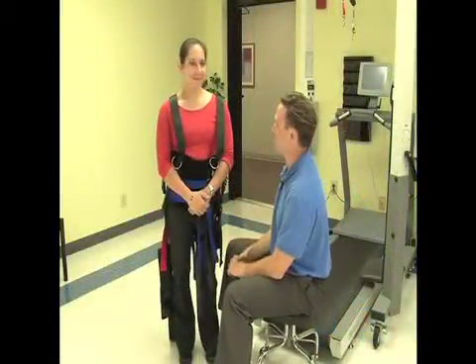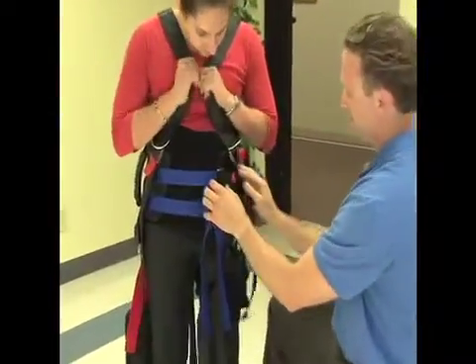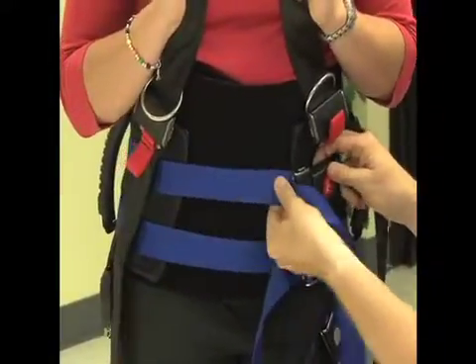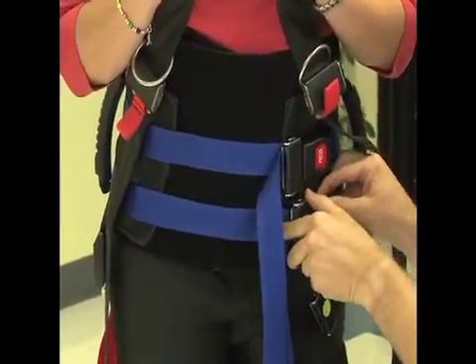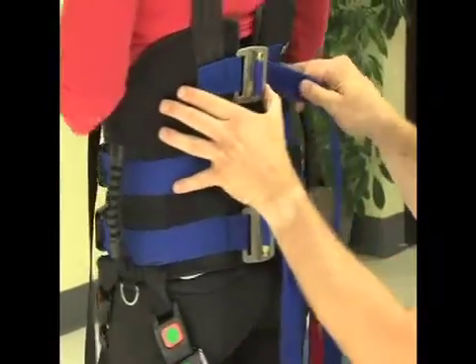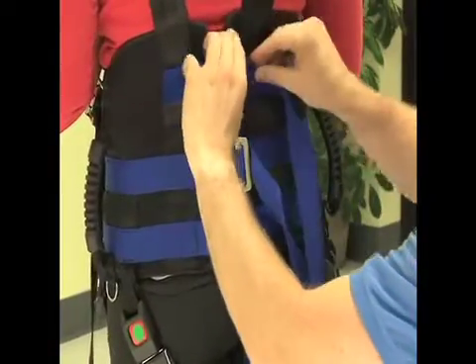As you can see right now the unweighing system harness is on Kate and it first starts off with the vest portion. The vest portion is attached in the front by two buckles and two fasteners and it has a blue strap that comes around the front — it's much like a seat belt, and that's how you can tighten it. In the back, we have three adjustments that can also be adjusted by either tightening or loosening them.